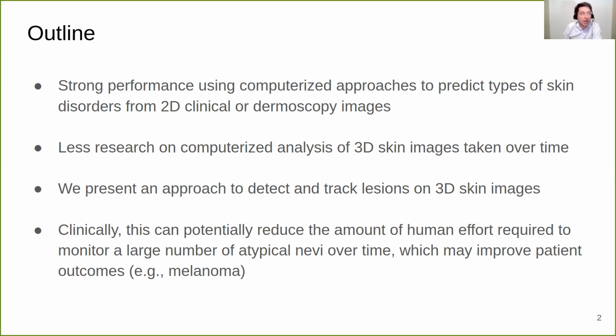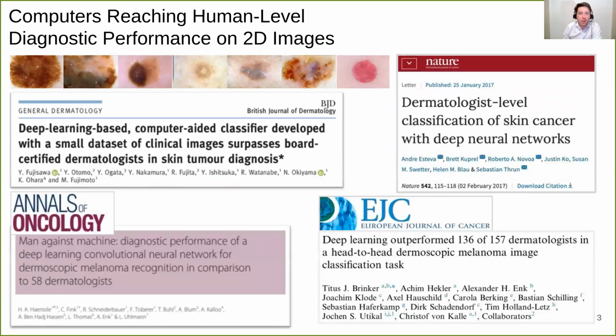skin images. Now, clinically, this has the potential where it can reduce the amount of human effort that would be required if we wanted to monitor a large number of atypical nevi over time, and this might help improve patient outcomes. So in the past couple of years, there's been several publications now that are reporting that computers are reaching human level diagnosis performance on 2D images, so typically using dermoscopy or clinical images.